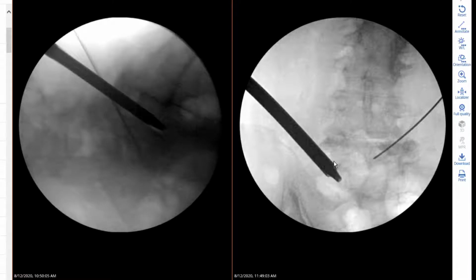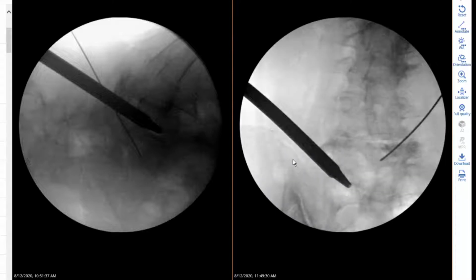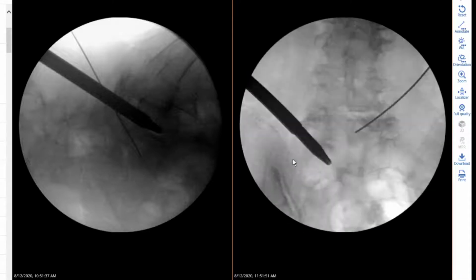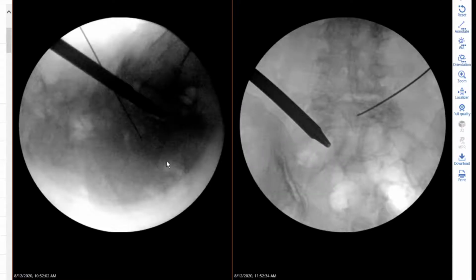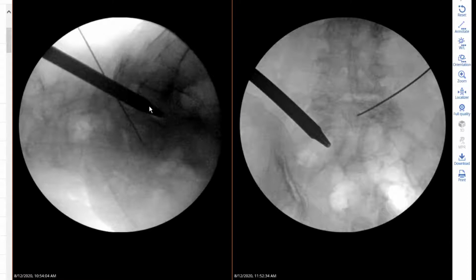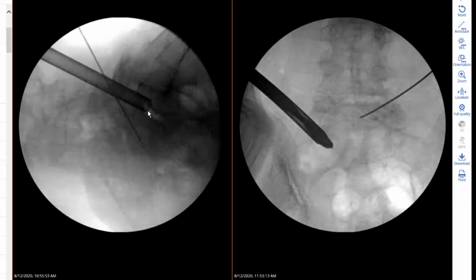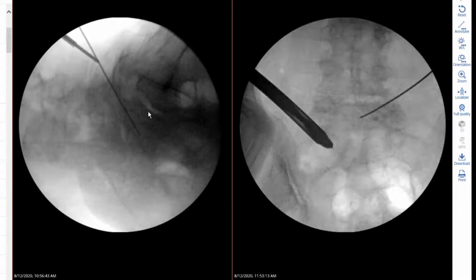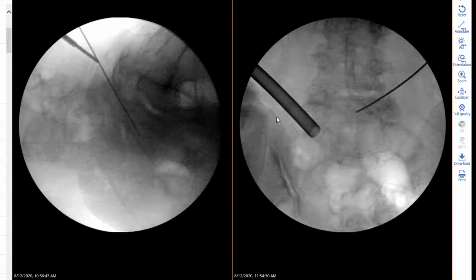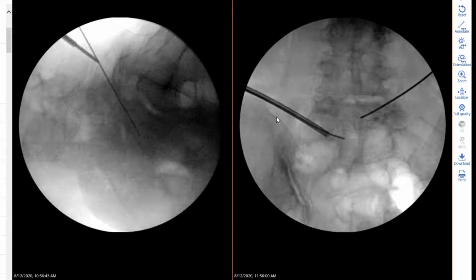We have noticed that the tube has to pass at least half of the pedicle, and once the tube is in place, as you see here, I notice at this point we have almost passed half of the vertebral body. And here the same. So we are almost half past the pedicle, but significantly advancing in the AP view, in the lateral view. So that would not give us enough space to work with. For that reason, I decide that this approach is not adequate, and decide to get a better approach, to medialize the approach a little more.